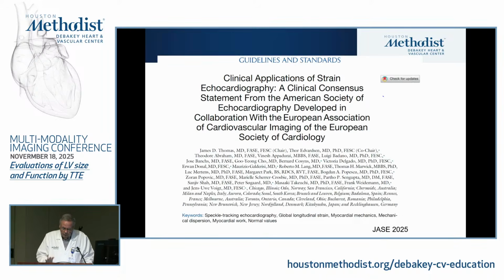So, hot off the press, there's this document which I encourage everybody to go through because it's very comprehensive on the clinical applications of strain echocardiography, a clinical consensus from the ASE and also the European Association of Cardiovascular Imaging and the European Society of Cardiology.